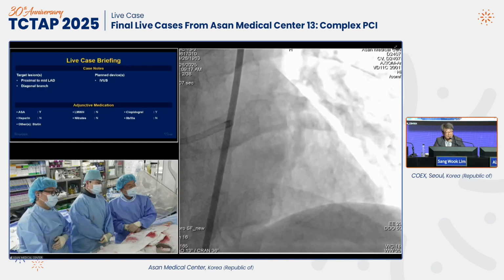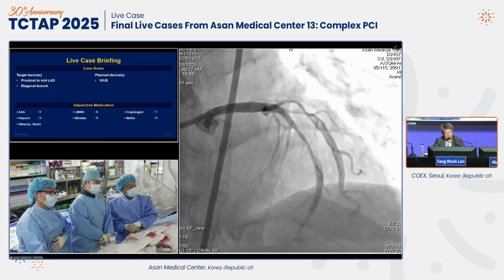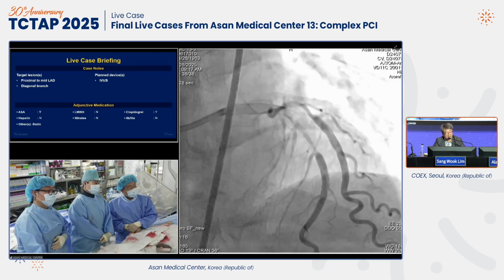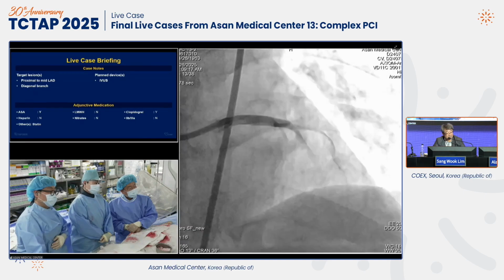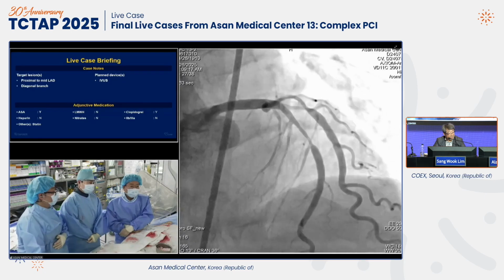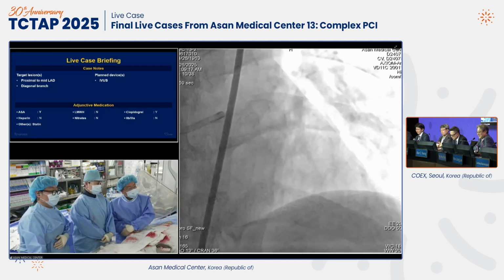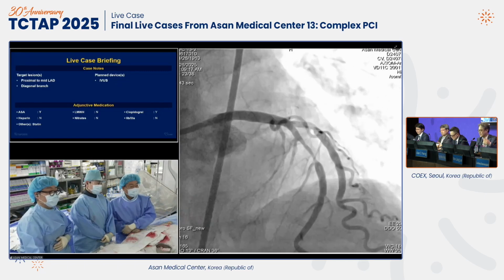Right? Does this patient have other clinical systemic disease? Actually, this patient is a relatively young female patient, so the disease pattern looks very ugly. I have some experience of arthritis or autoimmune disease. So did you check her other disease conditions? No, actually 62 is not that young, relatively young. However, I believe this is atherosclerotic change and so on. All right. Anyway, in terms of how to do this.